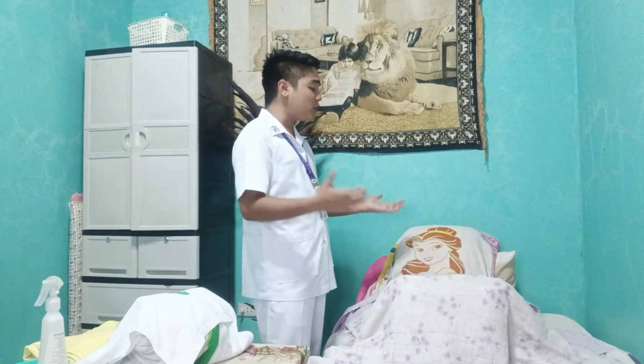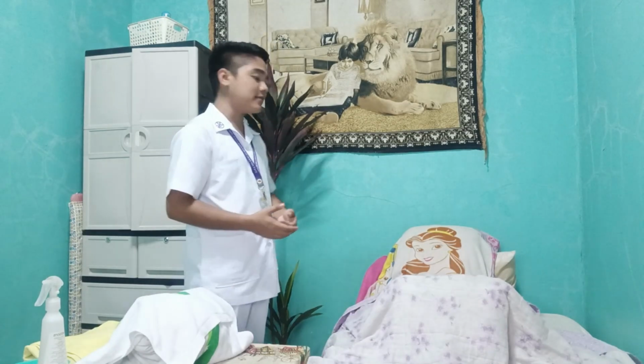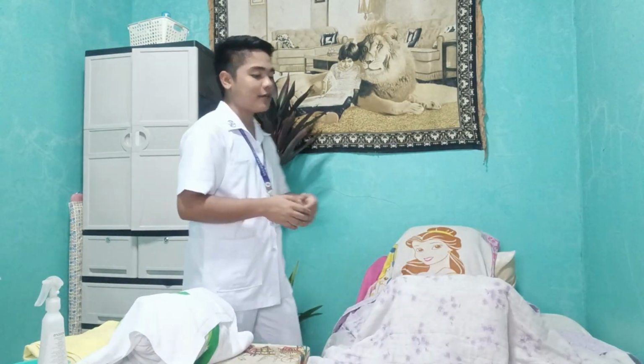The next thing that I am going to do is to drape the patient, exposing only the area to be used. This is done to keep the patient from getting embarrassed and having chills, which cause tension and which may interfere with the easy insertion of the catheter. Since my patient has already draped herself using her blanket, all we need to do is ask our patient her permission if we can expose her genitals. Ma'am, Lilibeth, can I expose your genital area, ma'am? Thank you so much. So let us expose our patient's genital area.